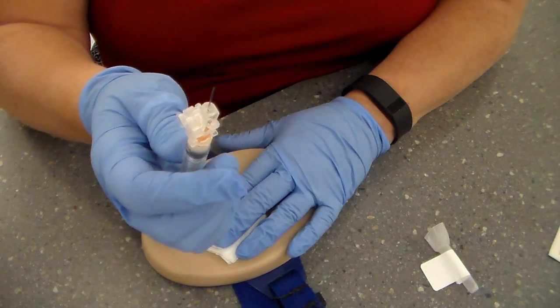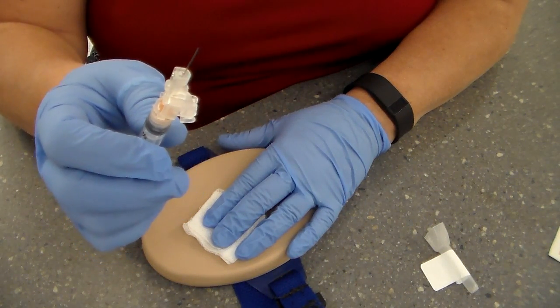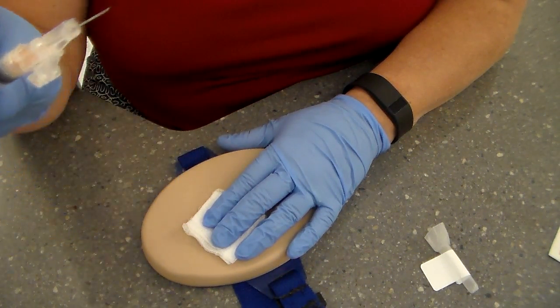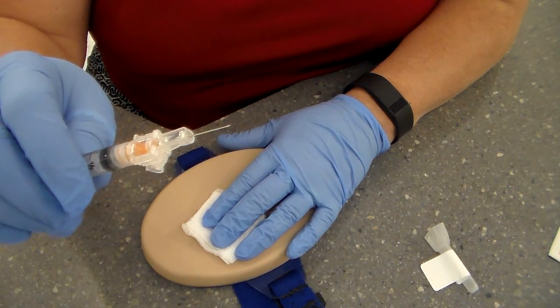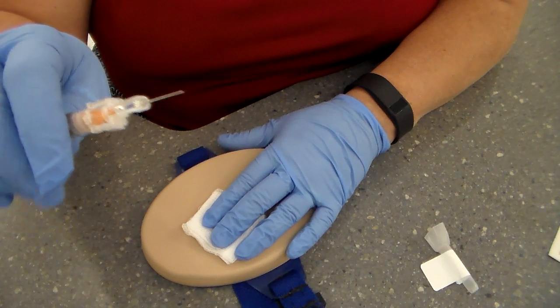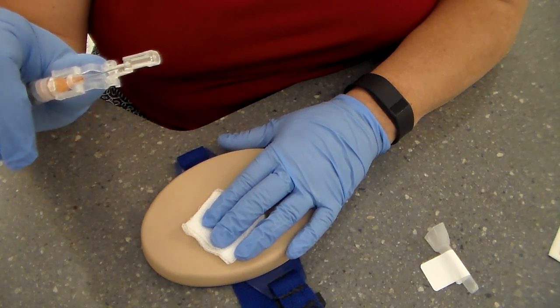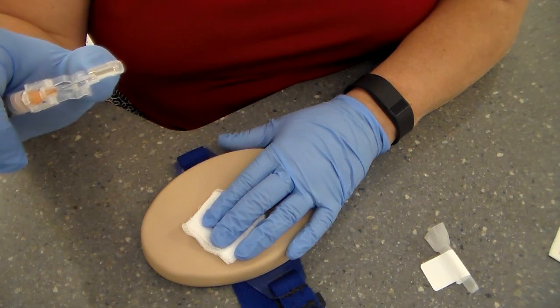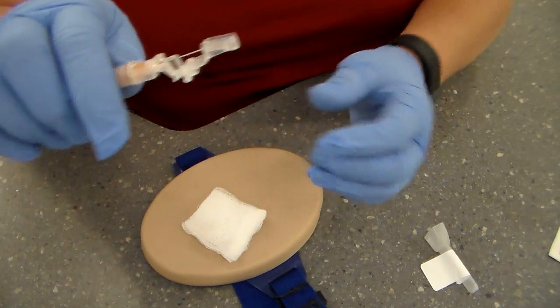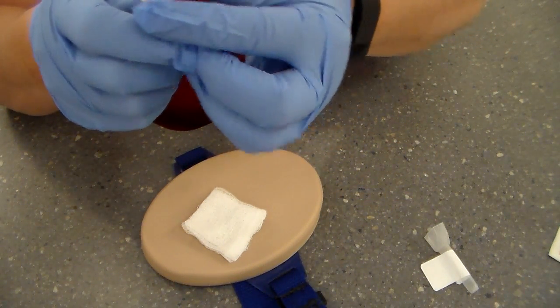Now we've got an exposed needle here. We don't want that because that means that we could really subject ourselves or somebody else to getting a needle stick. So we want to make sure that we engage the safety device on our needle. It depends on the type of needle that your facility is using as to how that device works.